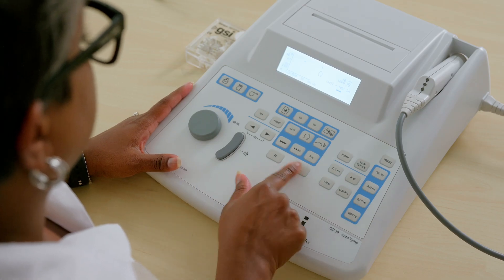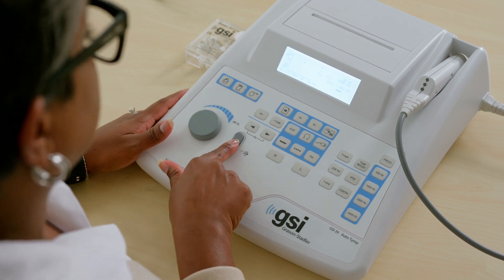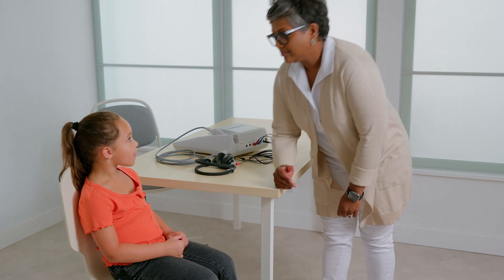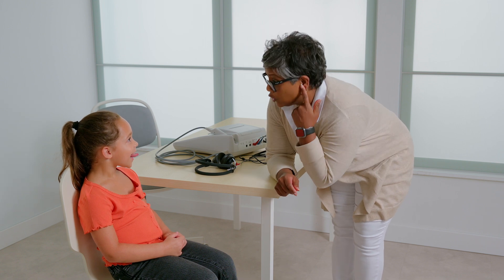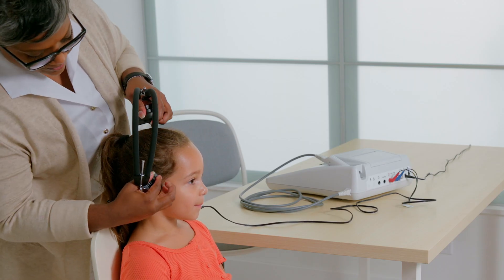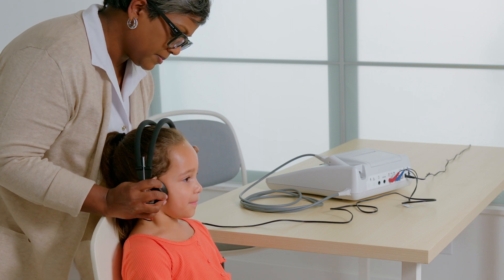The knob will adjust the presentation level and the presentation bar will activate the pure tone stimulus when pressed. Before placing the transducers, it is recommended that you inform the patient what to expect. Explain that you are going to place headphones over their ears and they will hear a series of beeps or tones. Instruct the patient to respond to the tones even if they are soft or far away, by either raising their hand or pressing the patient response switch. When the patient is comfortable, place the headphones over the patient's ears, making sure they are centered. Ensure the headphone labeled R is over the right ear and the headphone labeled L is over the left ear. The distance between the headband and the earphones can be adjusted up or down depending on the patient.